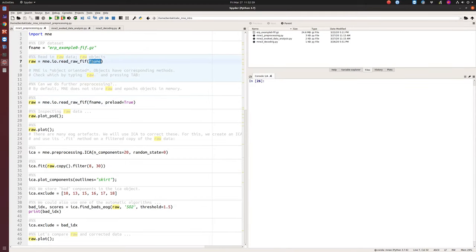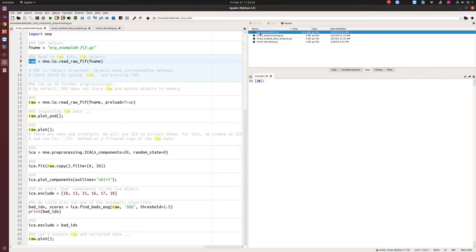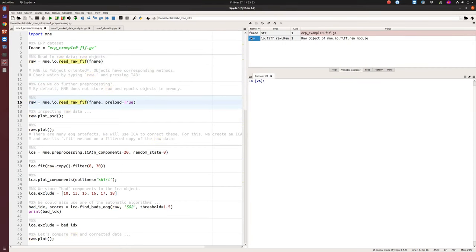The MEG data is quite heavy, so the MNE IO module provides two kinds of loading: first, just link to the file in the directory without loading it into memory; second, load it into memory. Here, we didn't load the data — it is referencing the file in the directory. If you want to load the data, you need to set preload=True.